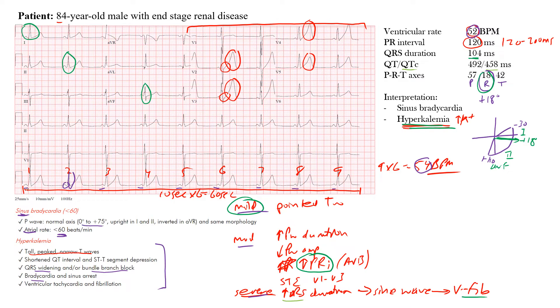The P wave axis is between 0 and positive 75 degrees — upright P waves in leads I and II, inverted in AVR, and upright in the lateral leads and AVF. All P waves have the same morphology, confirming sinus rhythm. This gives us sinus bradycardia: a sinus rhythm with a rate less than 60 beats per minute. Combined with end-stage renal disease, this should raise the suspicion for hyperkalemia.